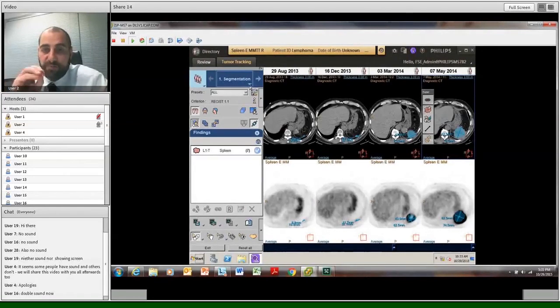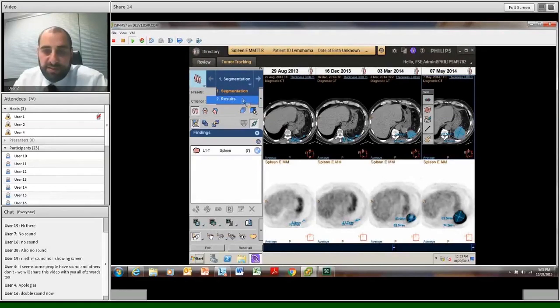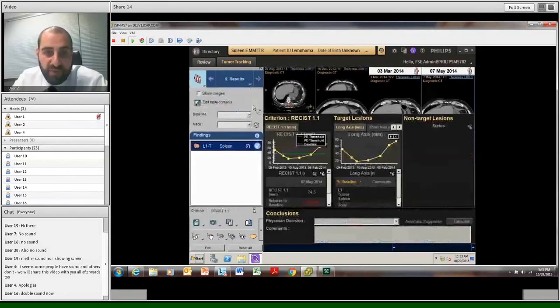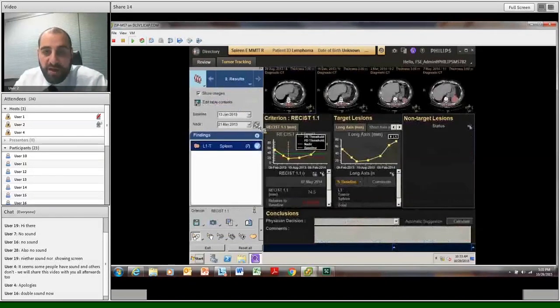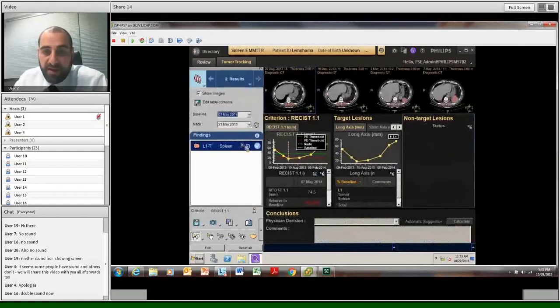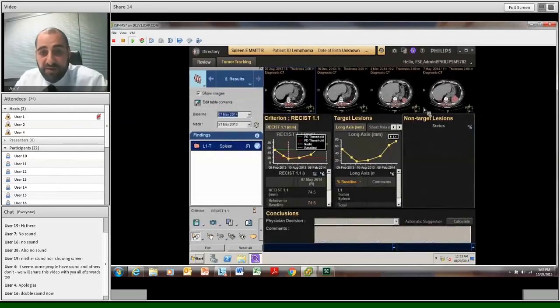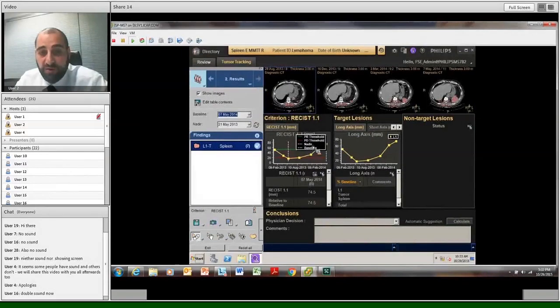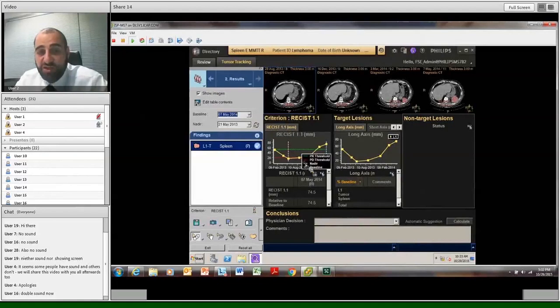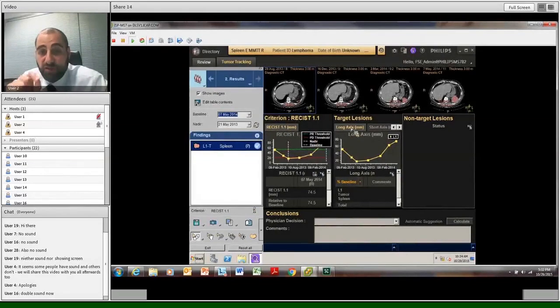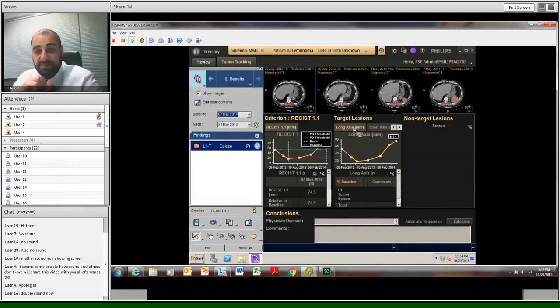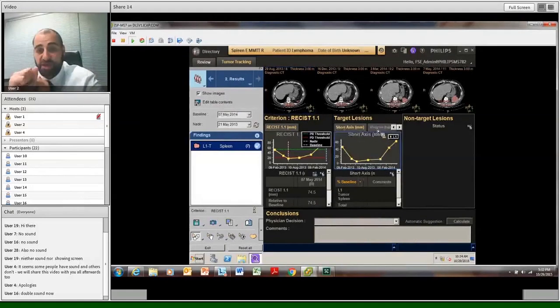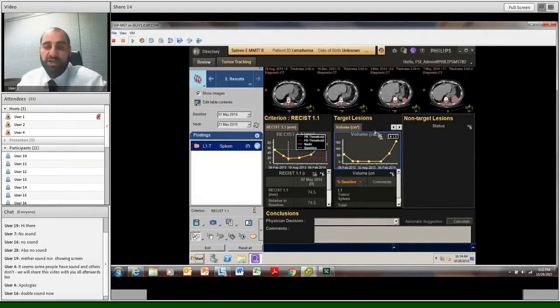What's even more important is this. Even though we have selected this, and we could have selected the wrong lesion in the wrong location, this advanced system, the ISP, allows us to tell us how confident it is by selecting the right match between the first lesion on the 29th of August and to the 7th of May 2014. And in this case, it's an 88.12% match. This now gives us greater confidence and consistency when looking at tumor invasion, tumor growth, and so forth.